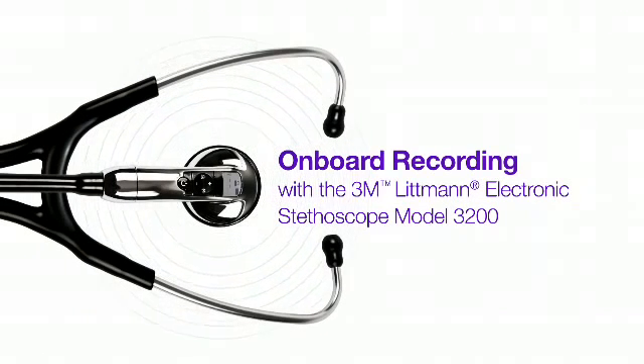This video will show you how to use onboard recording with your Littmann model 3200 to record and playback patient sounds.